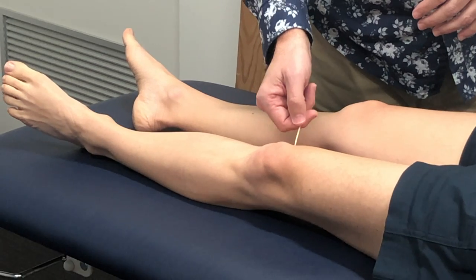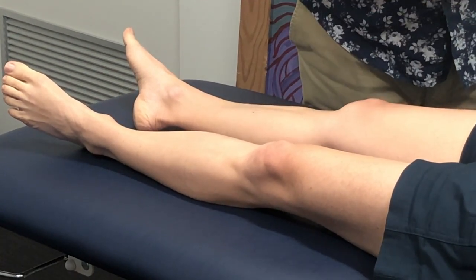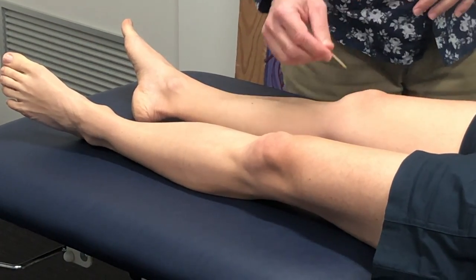First of all, I'm going to go on this side of this knee. What are you feeling there? So it's sharp. Yeah, okay, so that's normal. And then down here? Yep, sharp. Okay, so we'll just go to the other side.